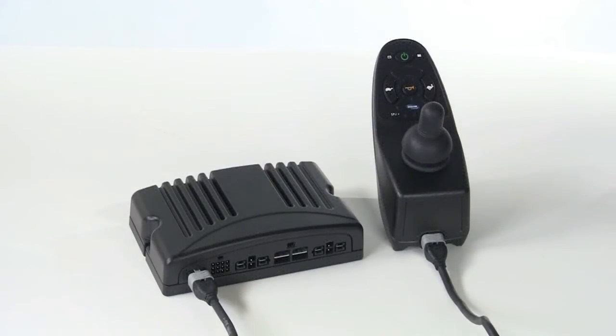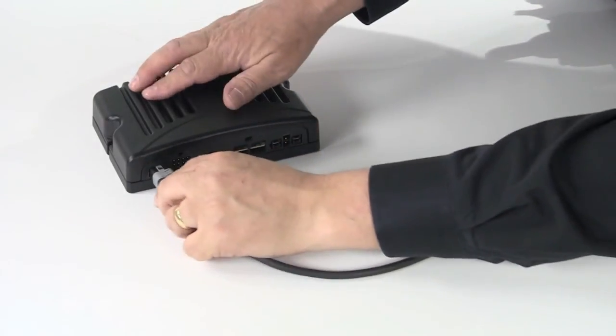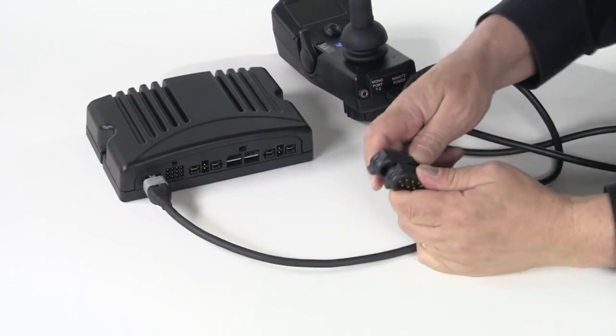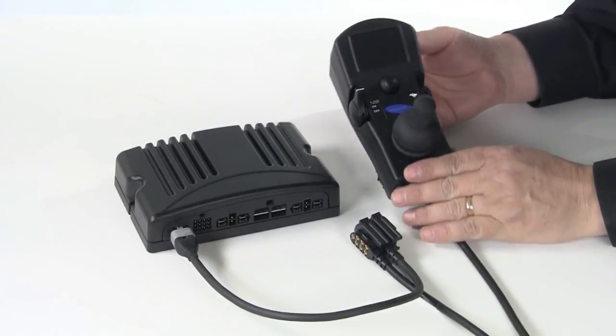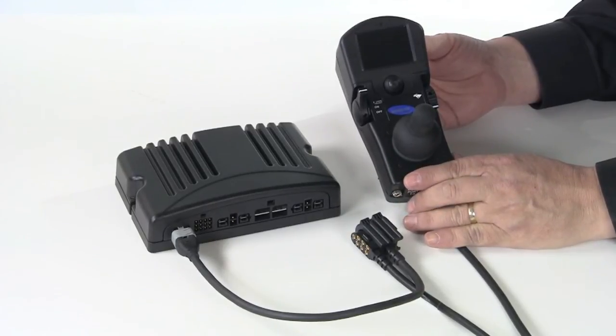Invacare uses the same controller or power module for both non-expandable and expandable systems. With a non-expandable system, the programming settings are maintained in the controller. The SPJ joystick, or non-expandable driver control, simply plugs into the controller. To upgrade to expandable, simply remove the SPJ joystick and the power wheelchair harness, then plug the expandable driver control — in this case the MPJ joystick — into the power wheelchair harness. For expandable systems, Invacare houses the intelligence that makes the system expandable in the joystick housing itself, not in the controller.